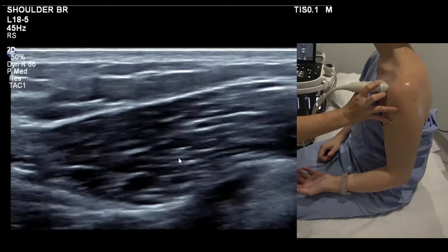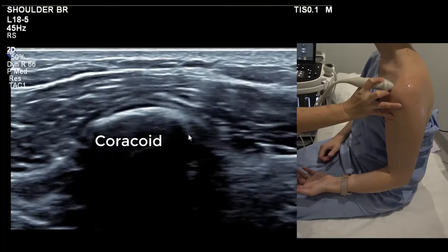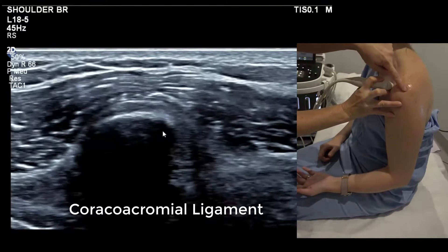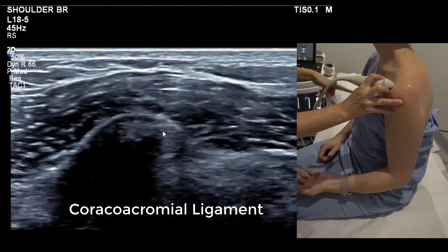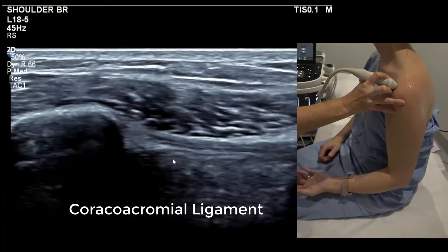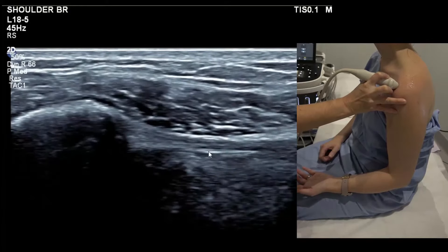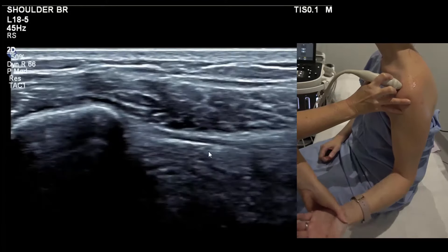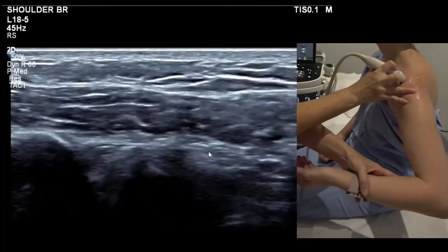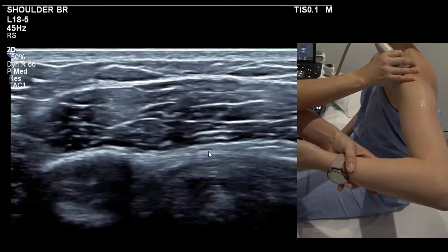The CA ligament is very easy. Go back to the biceps in its groove, slide over until you hit the coracoid — going up a little bit. Pivot on the coracoid because this is where the CA ligament attaches at one end; the other end of your camera points up to the acromion — roughly shoulder tip to opposite elbow. That's the CA ligament between the two white lines. You can do dynamics as well with internal/external rotation or lifting like a bird's wing — supraspinatus sometimes bunches under the CA ligament.